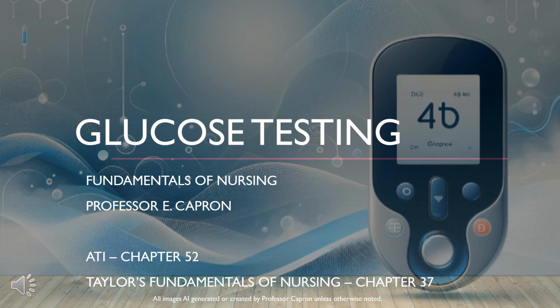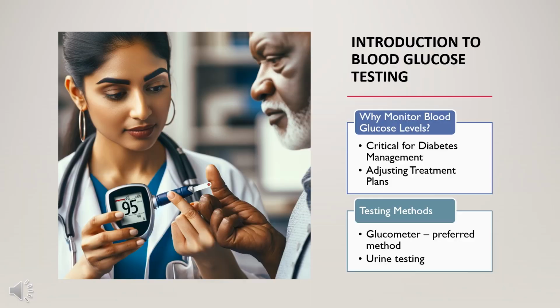This is Professor Capron, and today we're going to talk about glucose testing. You can find this information in your ATI Fundamentals book in Chapter 52, or in your Taylor's Fundamentals of Nursing book in Chapter 37. Blood glucose testing is a vital skill in nursing, especially for managing clients who have diabetes mellitus. So let's break down why monitoring blood glucose levels is so important and how it can be done effectively.